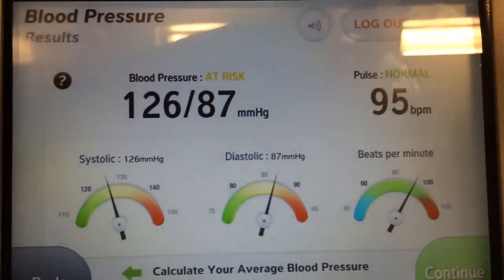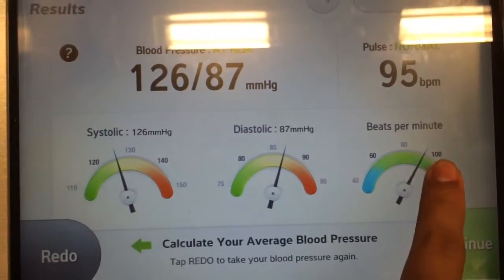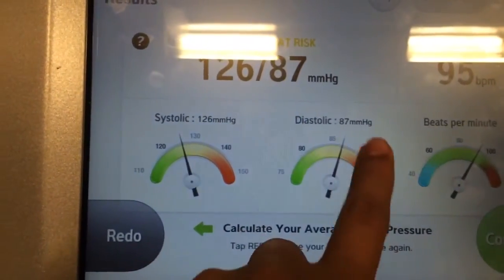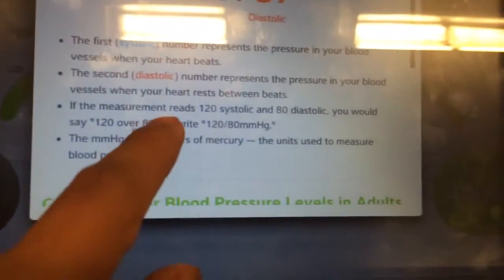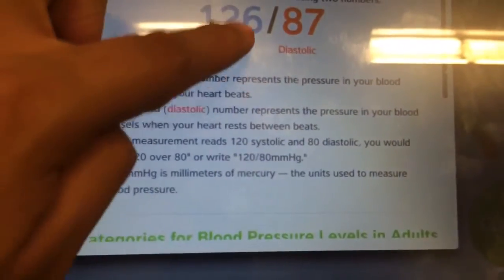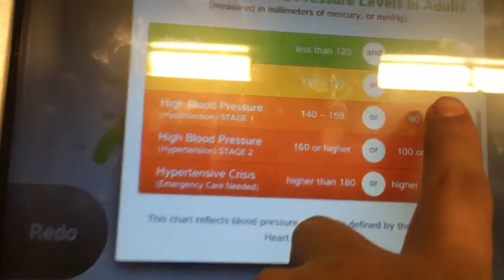My pulse is normal — it's at 95, which is a little bit high but still normal. This reading is high. I'm high by like six points. I should be 120 over 80.